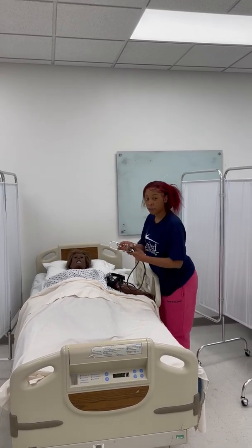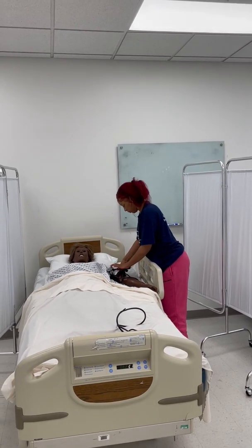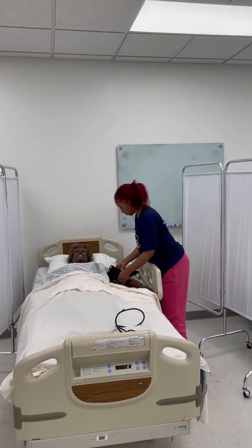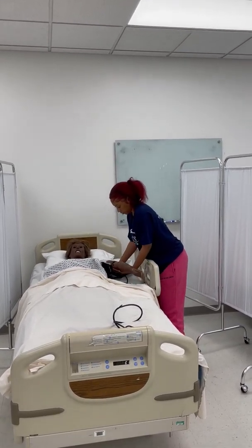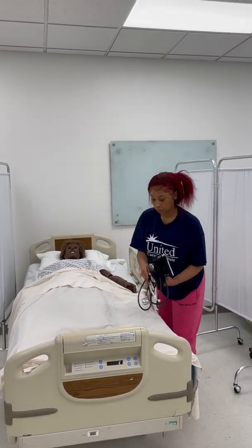I got 120 over 80. After the blood pressure and vital signs have been recorded, she will assess the patient again, and she will make sure that the patient is safe and comfortable and has all personal belongings within reach.